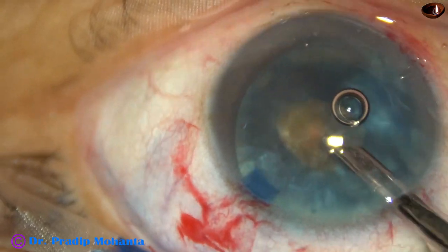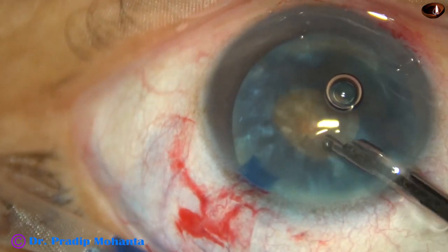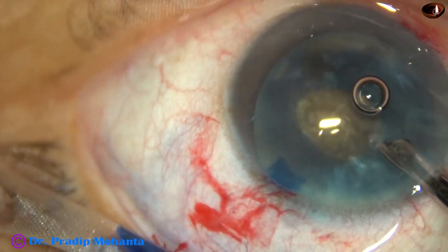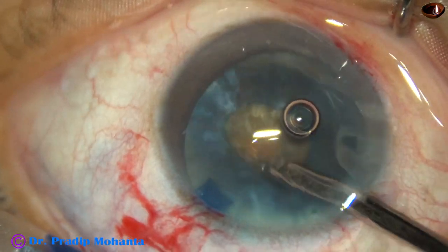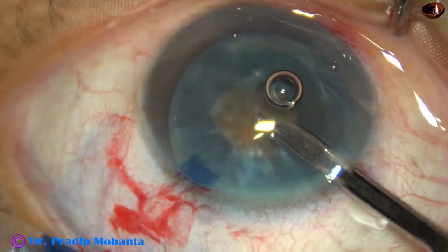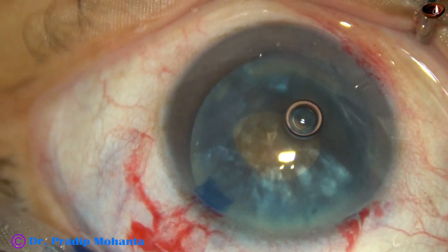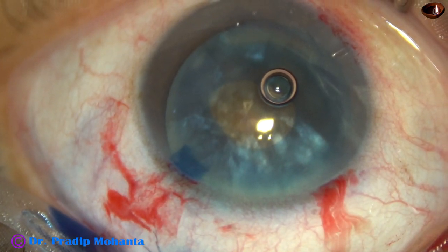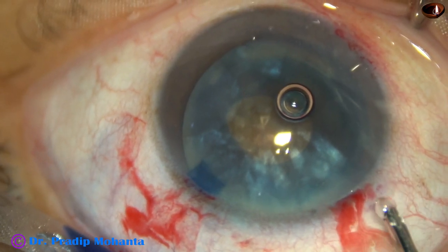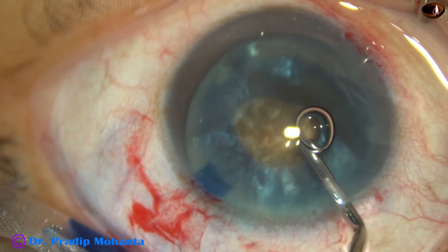Once this is done and the capsular bag is decompressed, there will be no tendency for the capsule to run to the periphery. The intumescence of the cataract is destroyed, and enlargement of this small rhexis will be very easy.